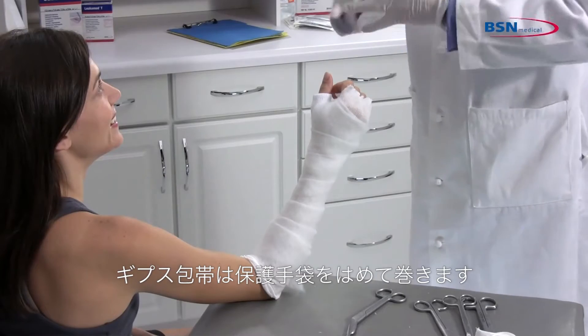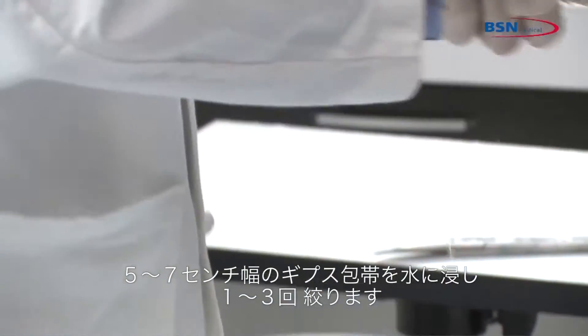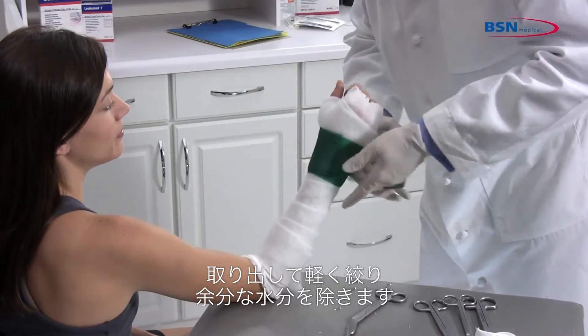Begin by putting on protective gloves before applying the cast tape. Dip 2-inch or 3-inch cast tape in water, squeezing 1 to 3 times. Then remove it from the water and squeeze 1 time to remove excess water.